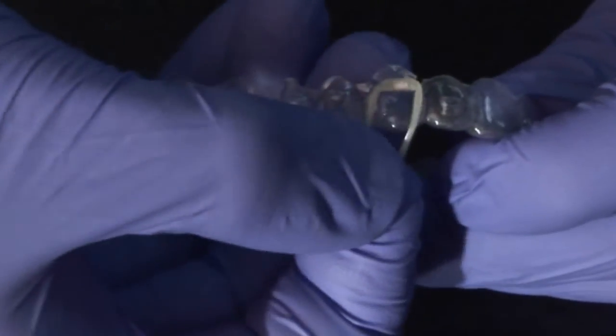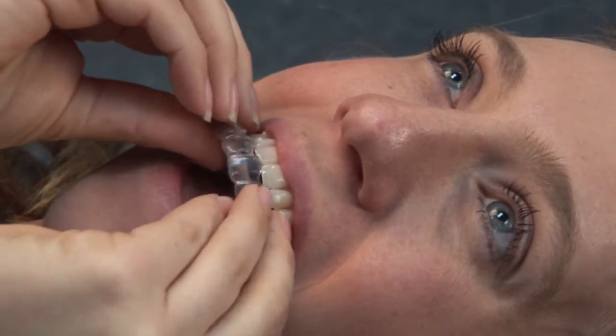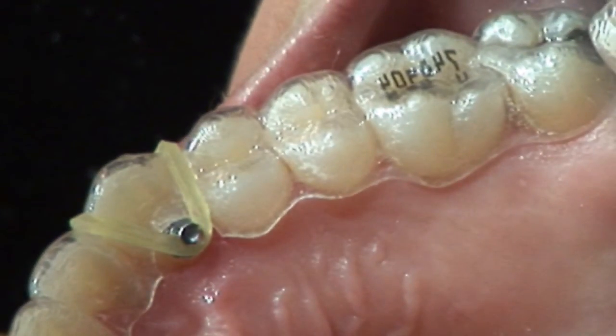Then an elastic is placed into those elastic hooks, the aligner is seated by the patient, and the elastic is stretched over the occlusal surface of the aligner plastic and finally hooked onto the bonded button. The tooth will then be extruded into the plastic aligner form for that specific tooth.